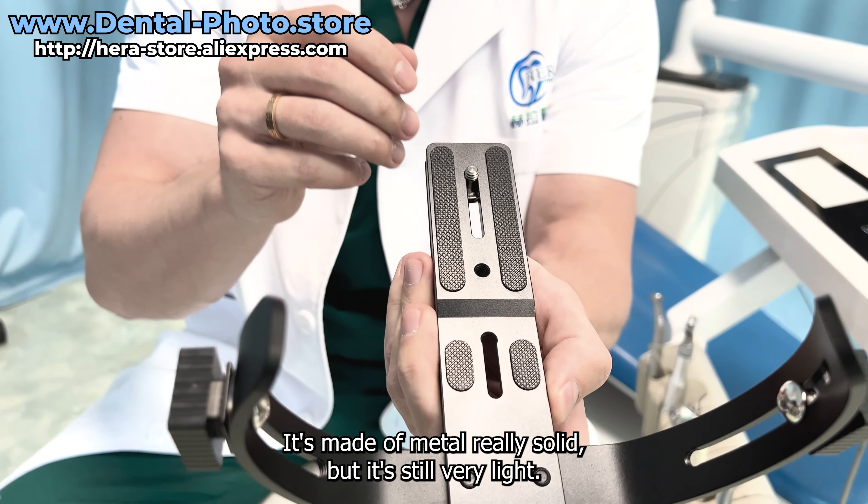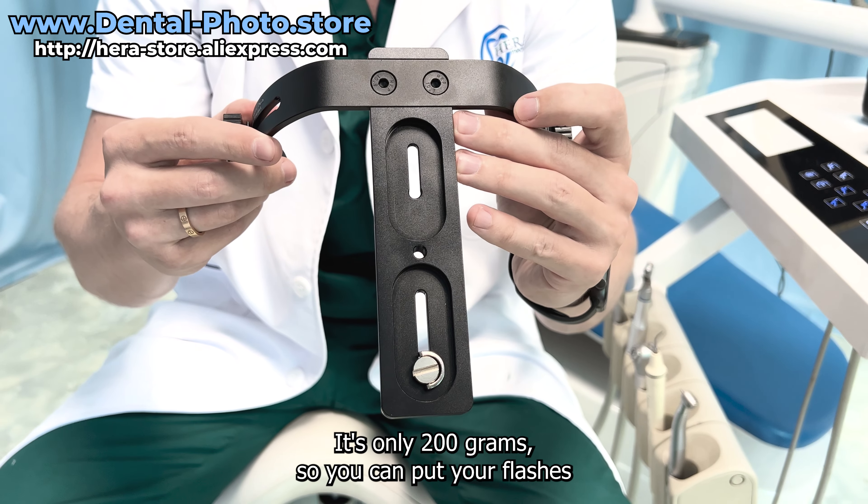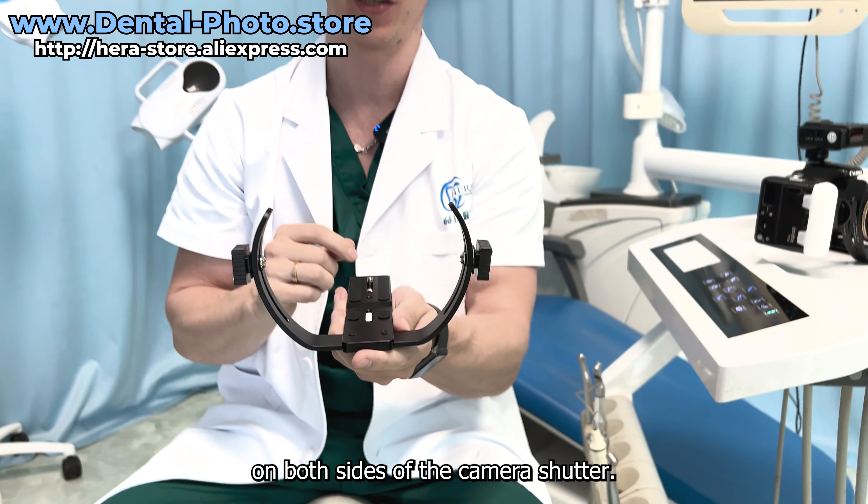Take a closer look. It's made of metal, really solid, but it's still very light — it's only 200 grams. You can put your flashes on both sides of the camera shutter.